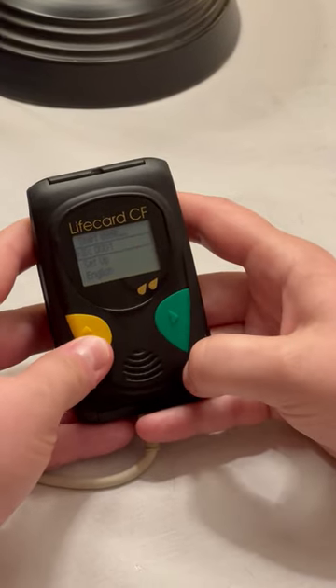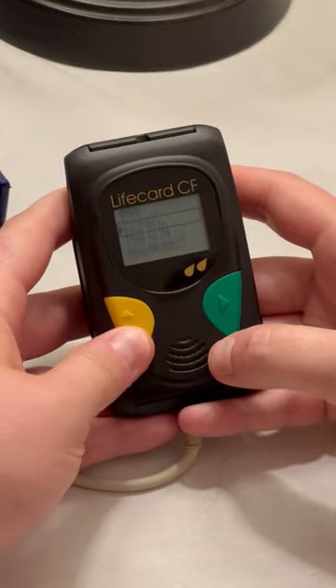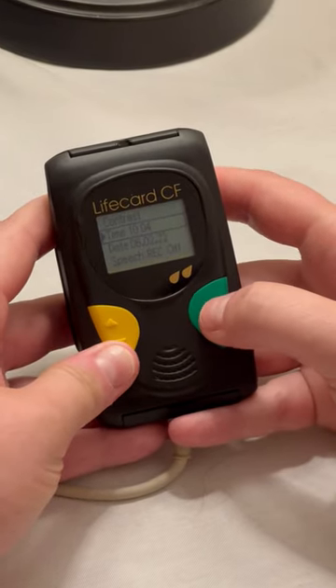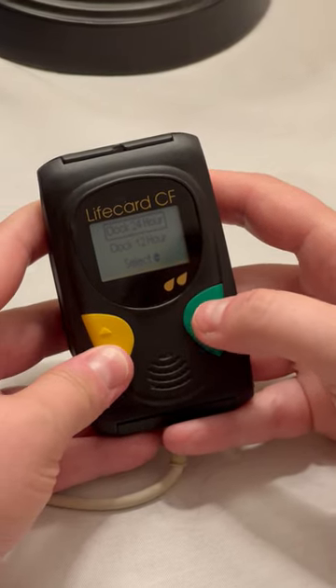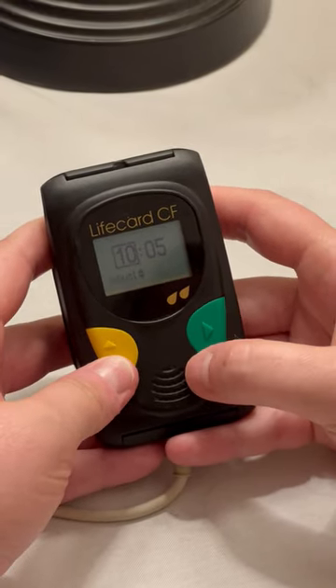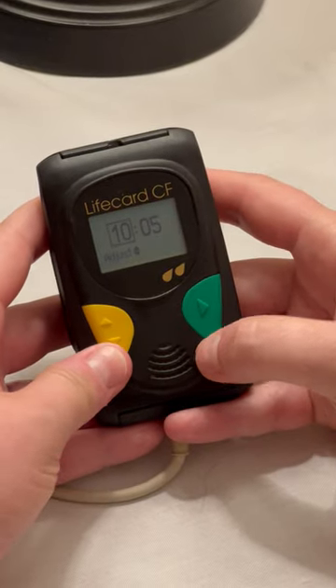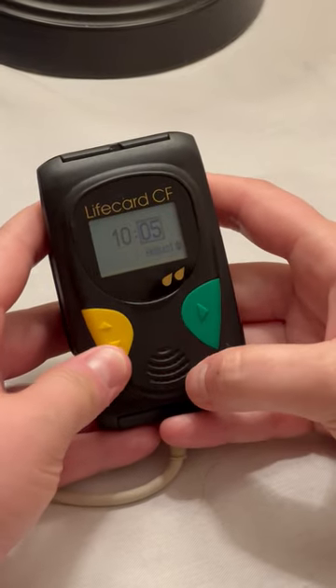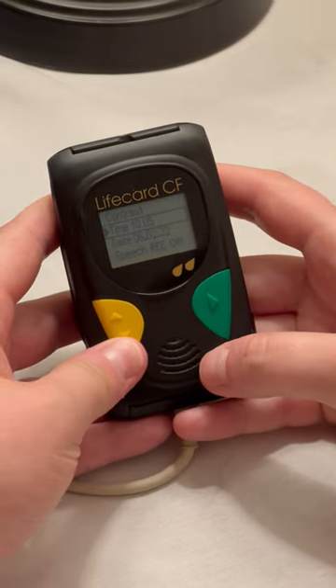We're going to skip the ID step for now and go to Setup. Hit the green enter button. We're going to go to the time — make sure the time is correct. If you need to adjust the time, hit the green enter button. You can set it as a 24-hour clock, military time. Adjust the time as needed. When you have the correct hour, hit the green button. When you have the correct minute, again hit the green button and that is set.